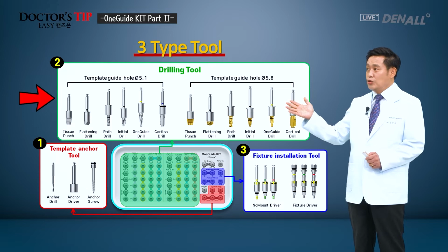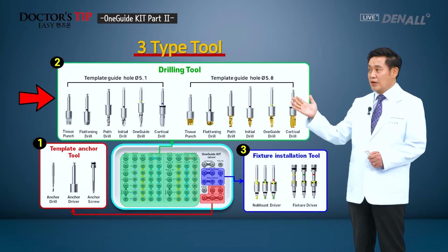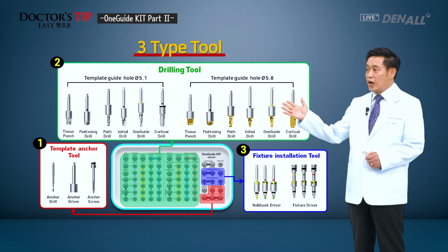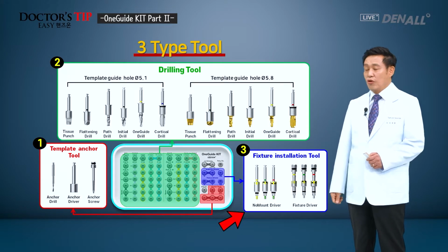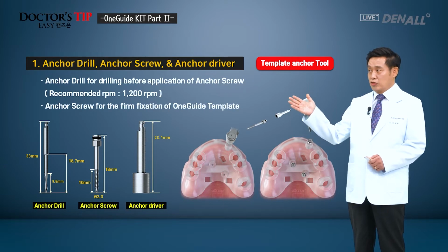Second is drilling tool. Basically, using OneGuide system, implant is being placed and drill is used for that end. Third, following the implant template, drill hole is created and fixture is placed, and this is a tool for that, and it consists of three tools. First is anchor drill, anchor screw, and anchor driver.